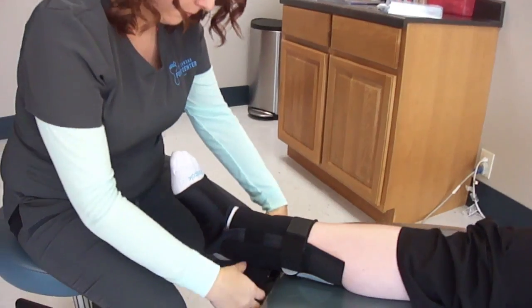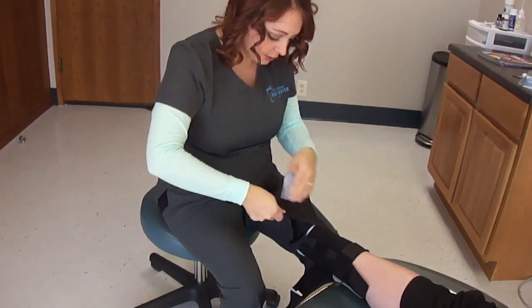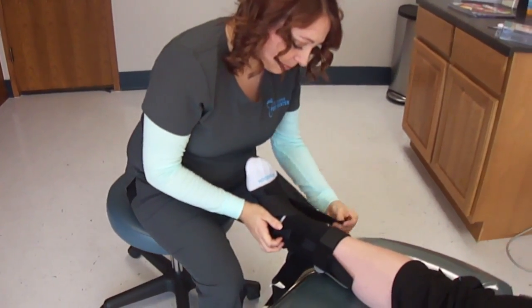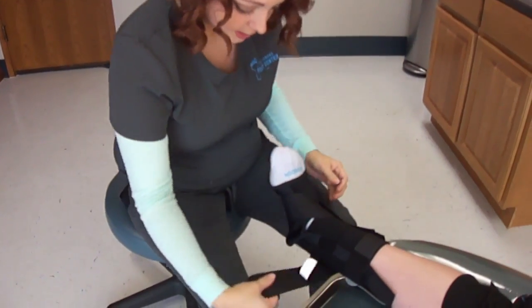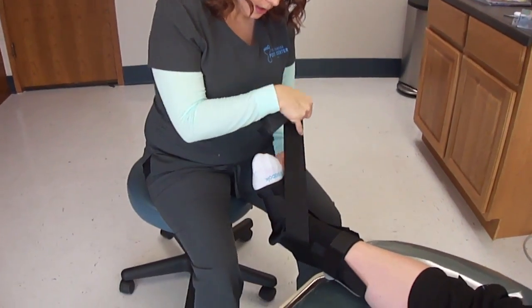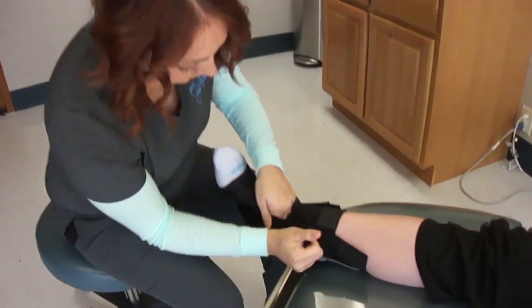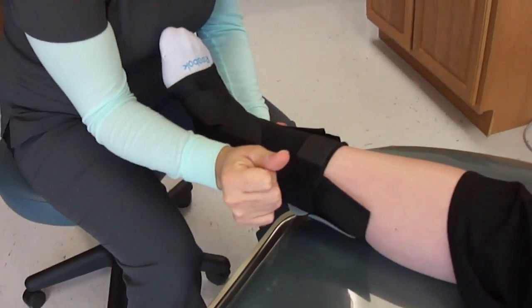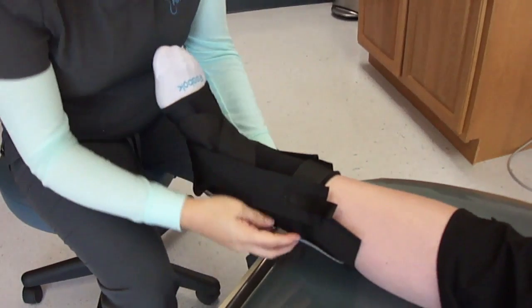Now you're going to do the outside one first. You're going to go over the top of the foot, coming down underneath the arch, connecting back up on the side. Then you take this piece, go over the top so you make an X, back underneath the arch, and up on the side. Dr. Truong usually recommends pulling this piece tighter, and that's what's going to provide you that support on the arch.